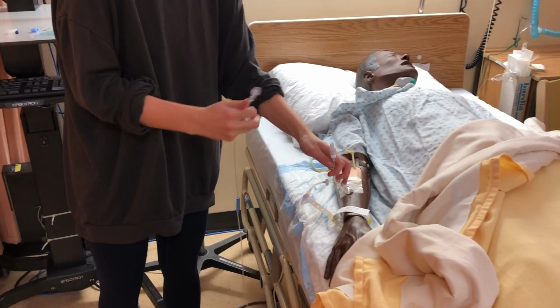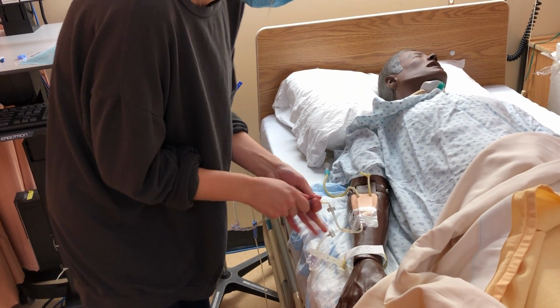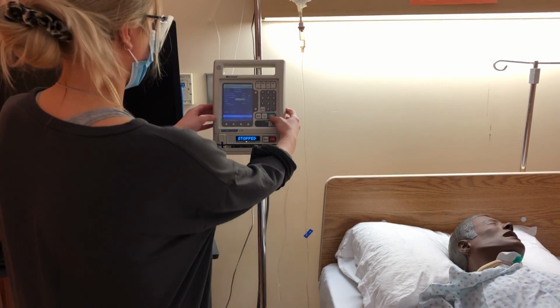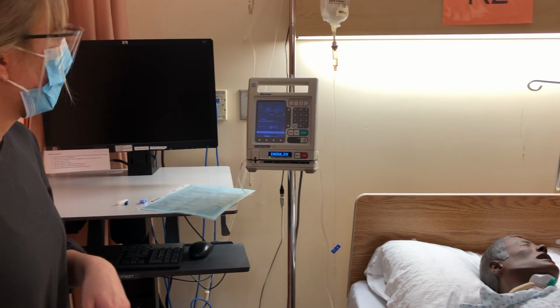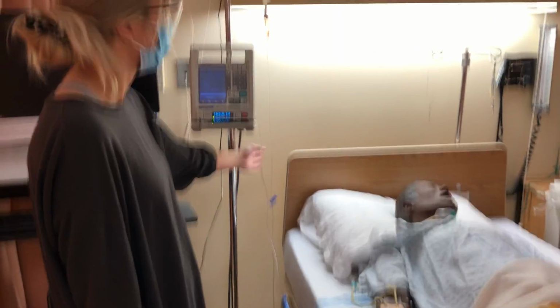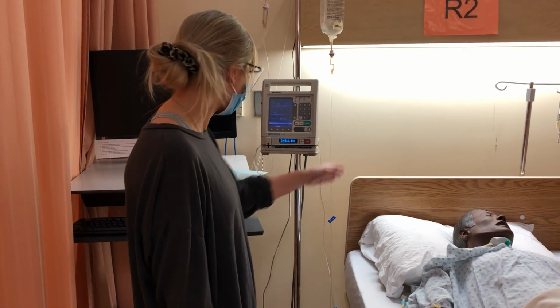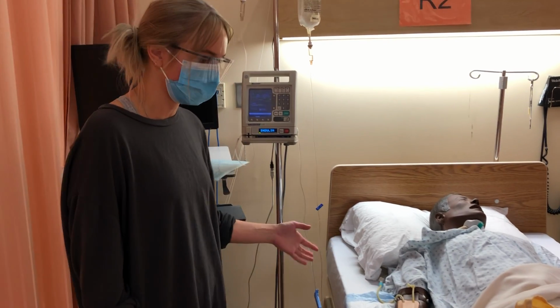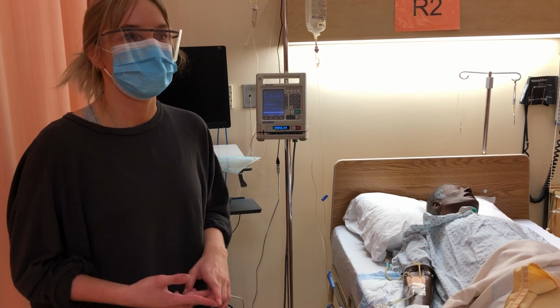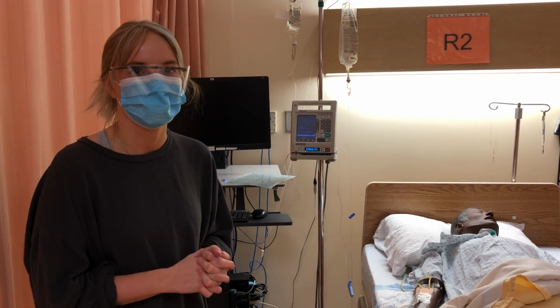So I have cleaned it, I have flushed it, and then I can attach. I can unclamp and press start. And I'm just staying, watching for 3 drips, making sure it's all connected. Our line is running TKO. I would do a safety check as I walk out. The call bell is within reach. He knows when to call me if he needs anything. And then I would go out to document on the MAR with a second nurse signature.